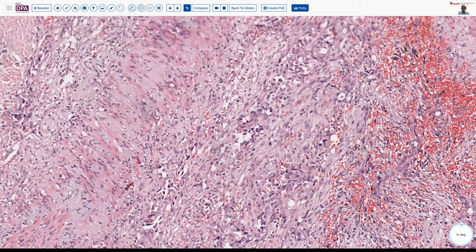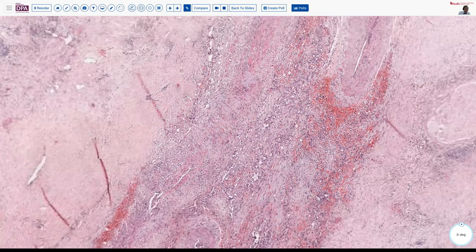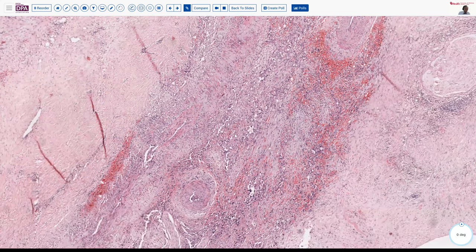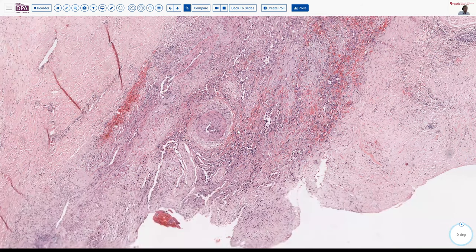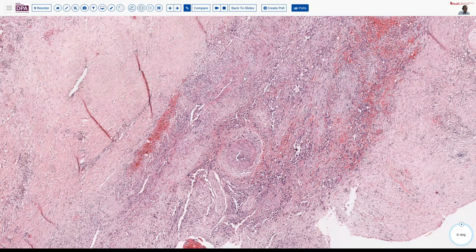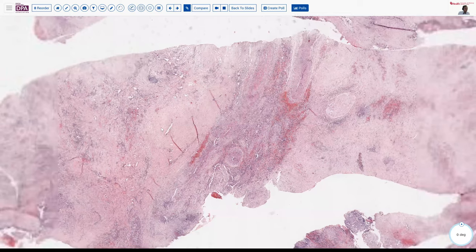Many times angiosarcomas can be mistaken for epithelioid neoplasms, carcinomas in some circumstances, or they can be mistaken for epithelioid sarcoma. And that's a particularly challenging differential at certain times, because many times in epithelioid sarcoma, you're dealing with a peripheral limb type lesion, and the number of neoplastic cells relative to benign surrounding reactive cells is quite limited. Differential immunohistochemistry, of course, can help you by identifying things like CD31 or ERG or other vascular markers in this type of lesion that would not be positive with an epithelioid sarcoma.